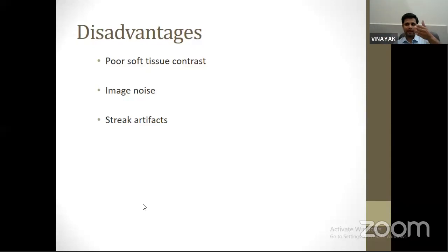Even when you place an immediate implant and it is slightly labially placed, and you take a scan immediately, you will see that there is no labial bone, but that is nothing but an artifact. The confirmation is that you placed it immediately and there was bone at that time. The clinical finding is confirmatory, not the CBCT finding. Because if it is too labially placed and very next to the cortex, then at times the cortex might not be seen. So this is another disadvantage of a CBCT scan.